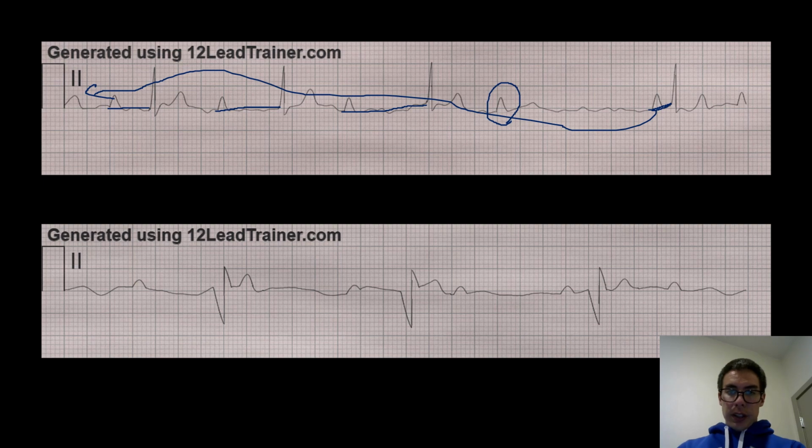And when we look at our intervals, QRS is wide. So that also points towards a ventricular rhythm. However, the weird thing about that is we have P waves, which you would not expect for a ventricular rhythm to be able to see P waves, but we do. So what that tells us is this is probably a third degree block because everything else points to ventricular, but we do have visible P waves, which shouldn't be the case if it were just a purely ventricular rhythm.